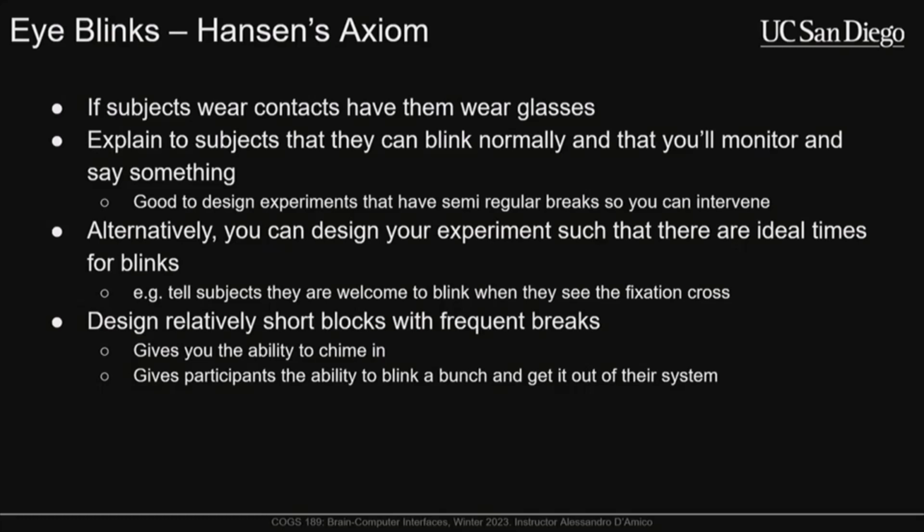I had a research assistant that wore glasses, and the reason I added my automatic artifact detection was because of him. When I would collect data from him, he just could not stop blinking. During the online phase of the BCI, he was blinking nonstop, and I thought, okay, I need some system to detect these blinks so that I can make sure I'm recording 30 good trials from him.